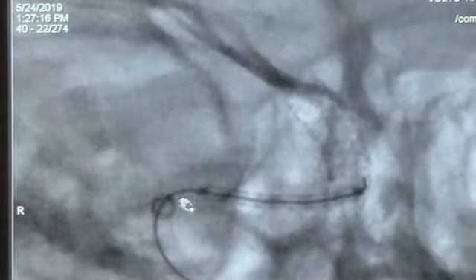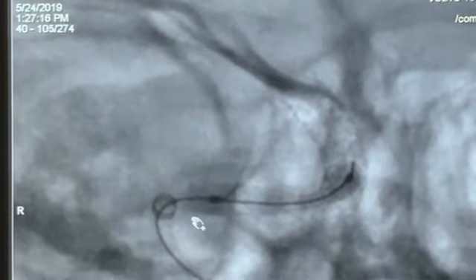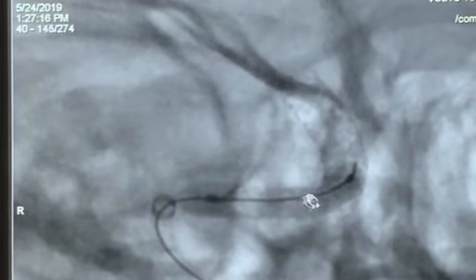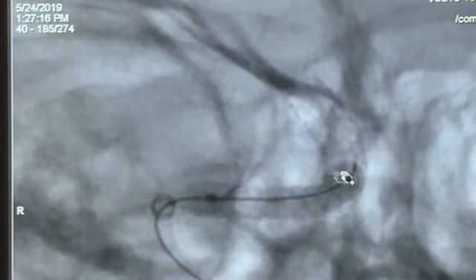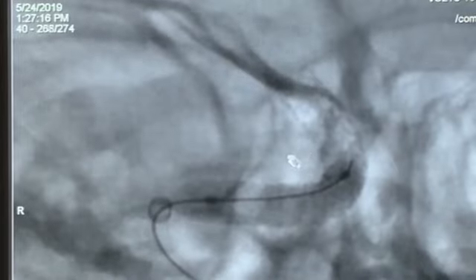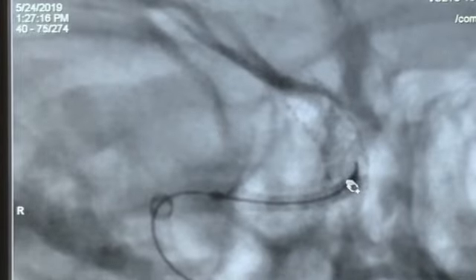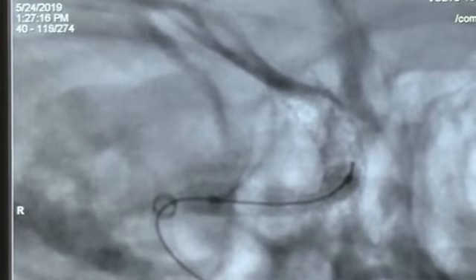So this can happen when the proximal or distal end of the graft is sitting at an angle over the internal carotid artery. I decided to take another Graftmaster over here. This is the first Graftmaster, and this is the second, just getting inside it. So just a small apposition and then bring it back, because this bend is allowing the blood to seep between the vessel wall and the graft. So I've taken another graft and am just deploying it from the proximal part of the Graftmaster down.